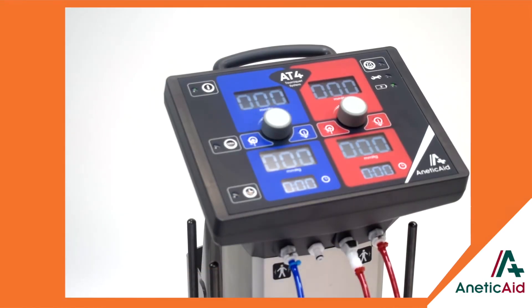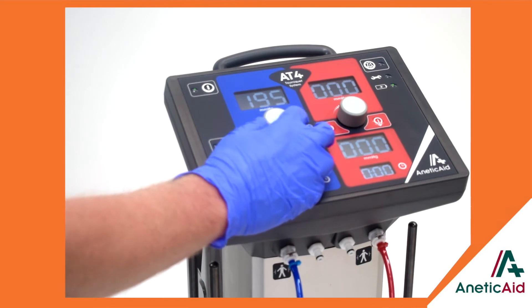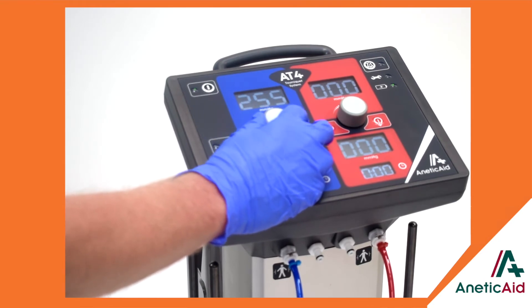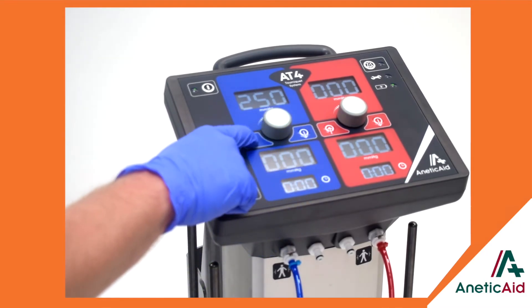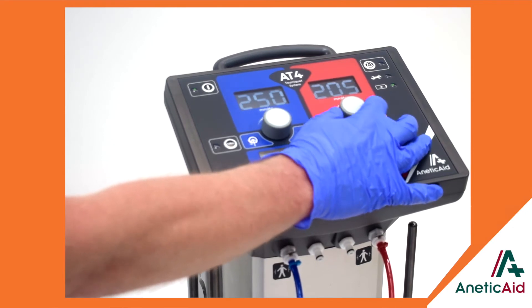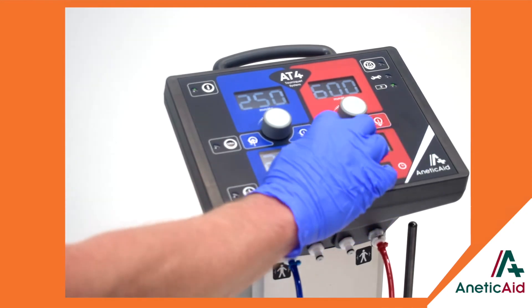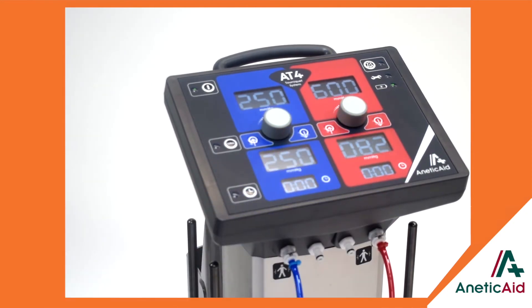Looking more closely at its features, the AT4 runs microsecond interval self-diagnostic checks on start-up and throughout its use. There are large, conveniently positioned and angled OLED displays for pre-selected and applied pressures, elapsed timer displays, precision control dials to select pressure control on independent colour-coded channels, with a working pressure range of 0-600 mmHg, and quick release safety connectors with convenient home storage positions.